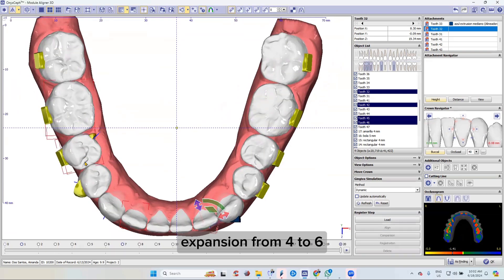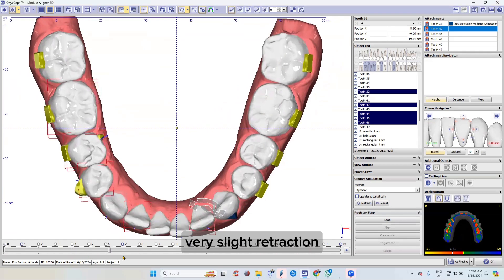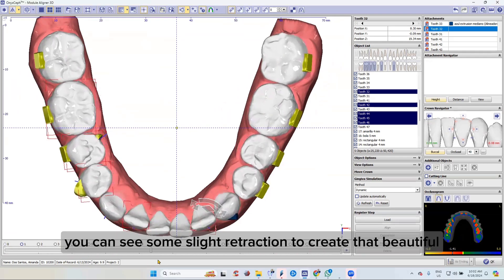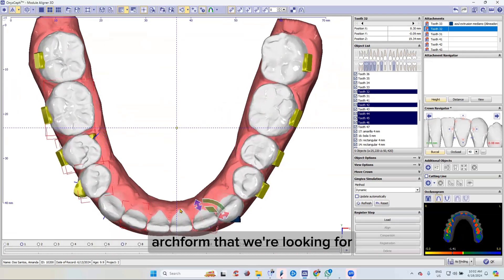As always, you can see my posterior protocol of expansion — expansion from four to six, the mesialization or rotation of seven, and some slight retraction. You can see some slight retraction to create that beautiful arch form that we're looking for.